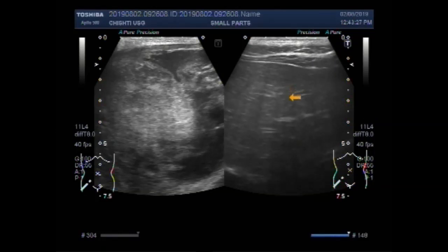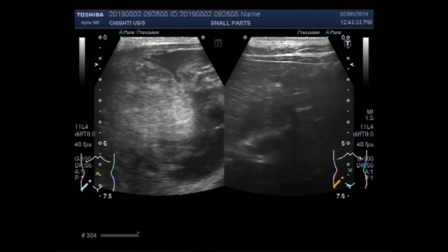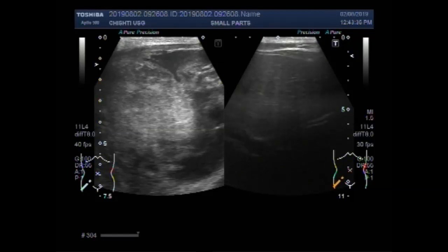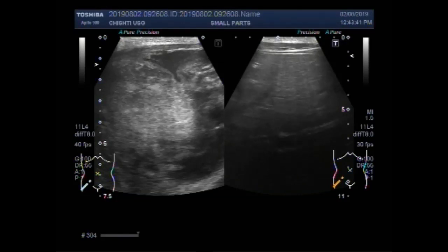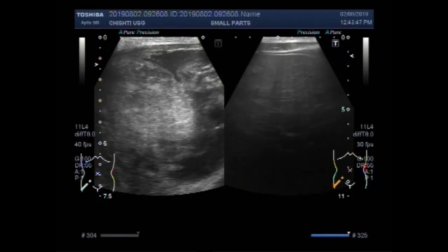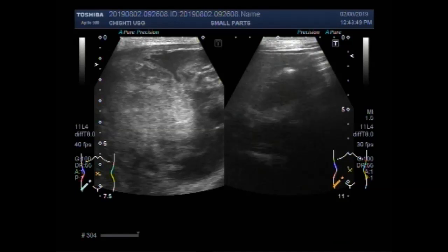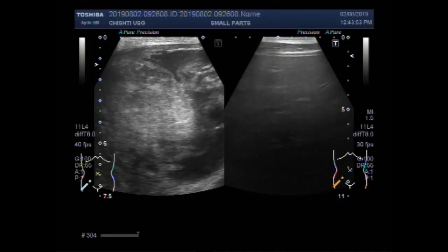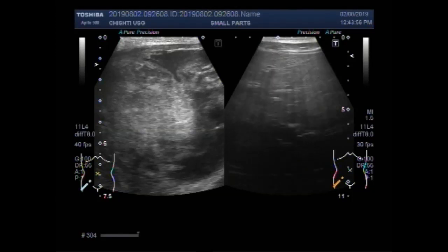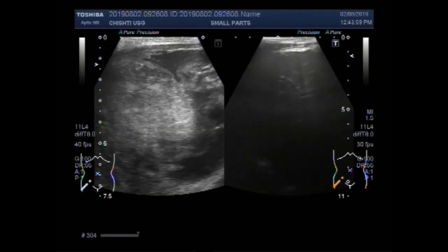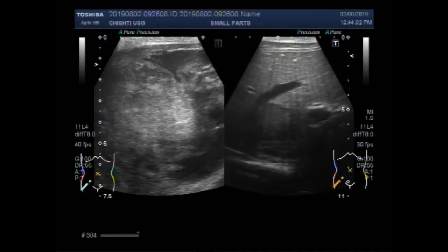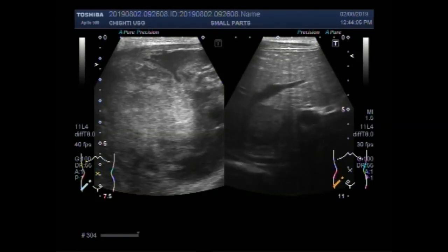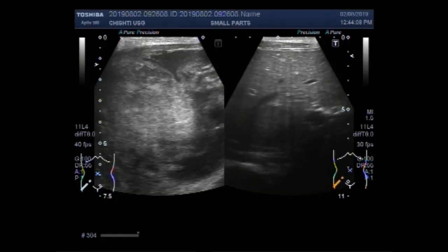Now you can see the scanning of the liver. This is the liver, and this scan was done with a high-power linear probe. The scanning of the liver was a bit difficult. However, you can now see a mass in the lower portion of the left lobe of the liver.